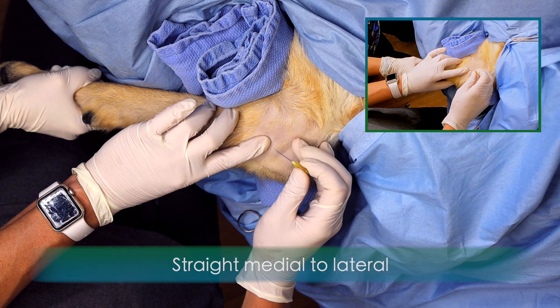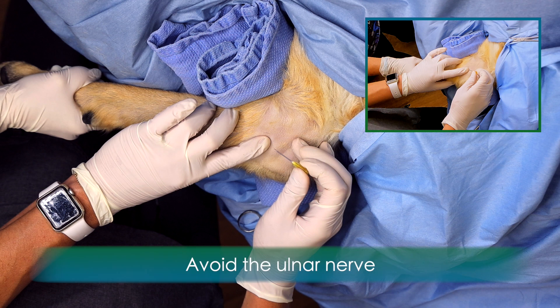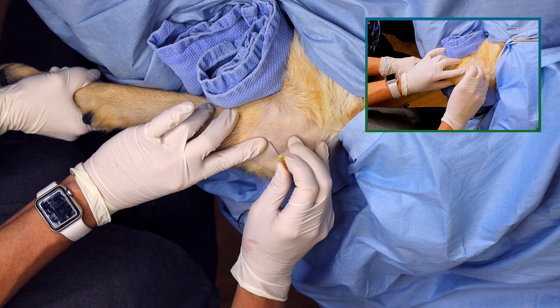In a medium-sized dog, this might be less than a centimeter. Avoid penetration of the ulnar nerve, which can be palpated caudal to the humeral condyle.